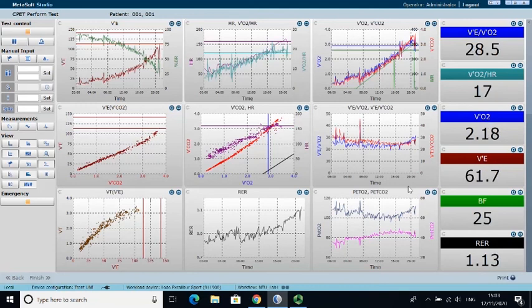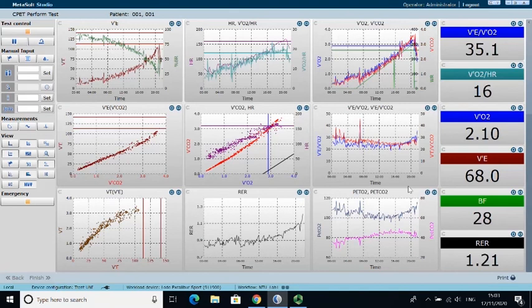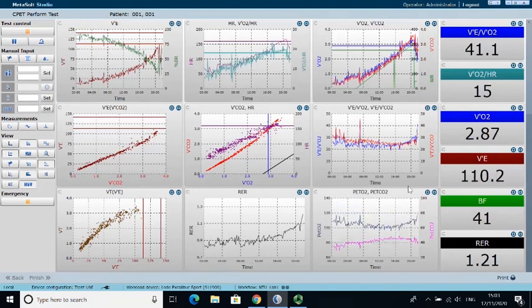his oxygen consumption was about 3.3 at peak. His maximum ventilation was in and around 100 litres per minute. So they're in and around the values that I told you to have as a real ballpark figure. But it's important that you put that into the context that Matt is a 24-year-old, healthy, fit young man. And so if that isn't the case, then obviously you're going to need to shift your expectations accordingly.